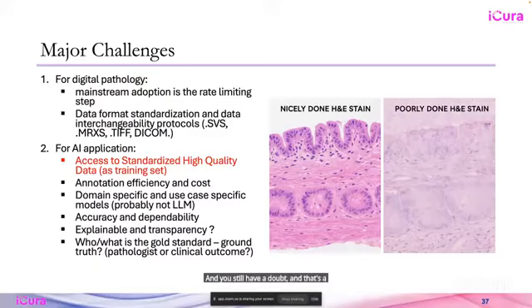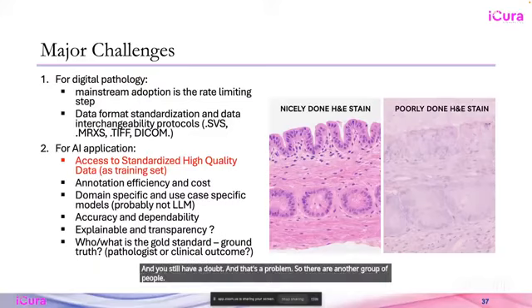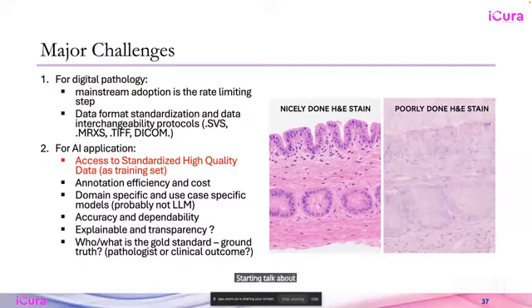So another group of people are starting to talk about explainable and transparent AI, meaning that even though the AI did most of the work, humans can still understand how the AI inferred or came to that conclusion, which is also another very difficult area to conquer.